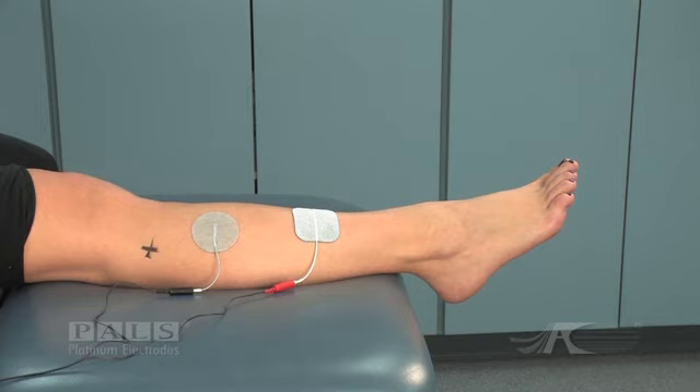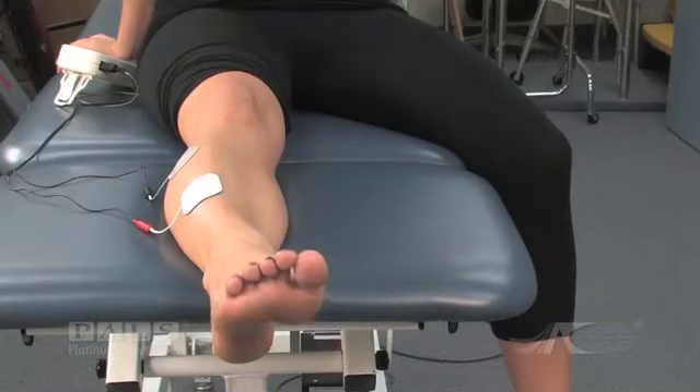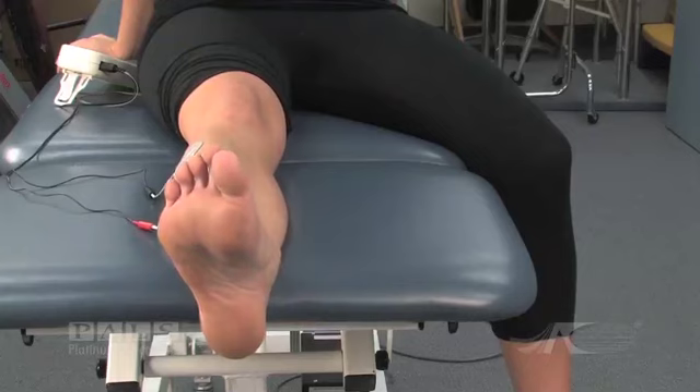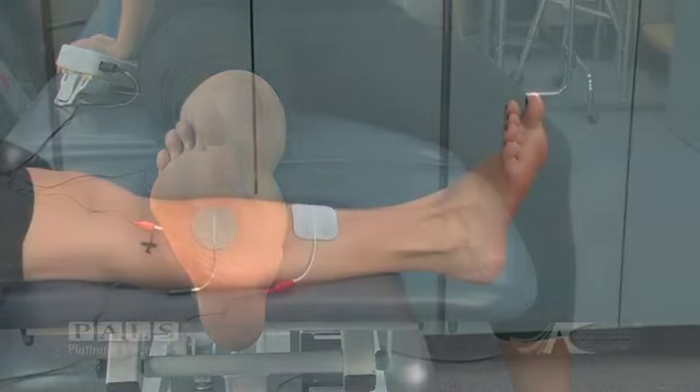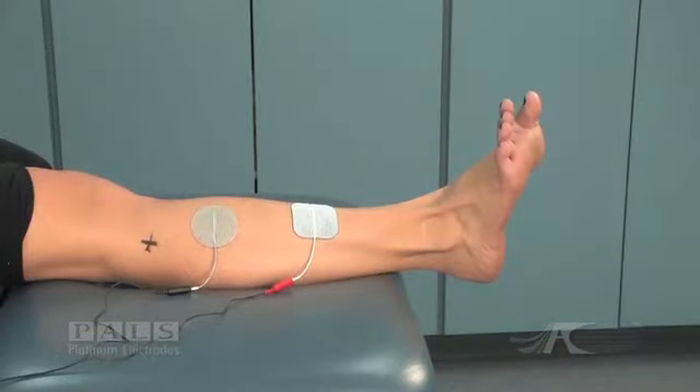the negative electrode has been moved laterally on the anterior tibial muscle about one centimeter. The resulting stimulation activates the peroneus longus muscles as well as the extrinsic toe extensors, resulting in inappropriate eversion and toe extension. This is not acceptable for therapeutic purposes.